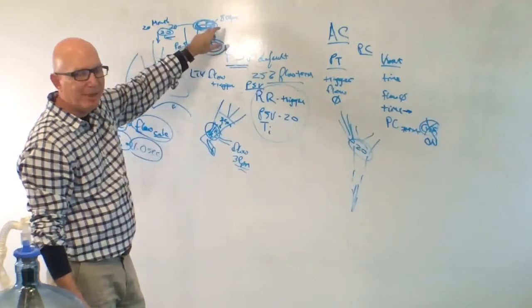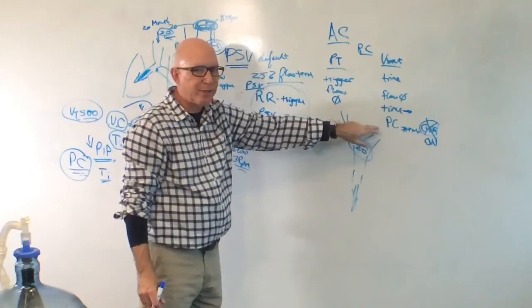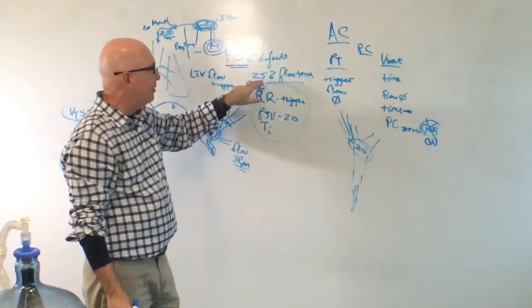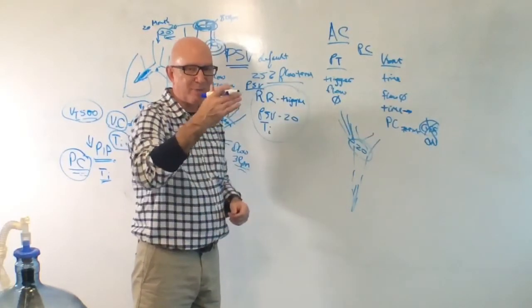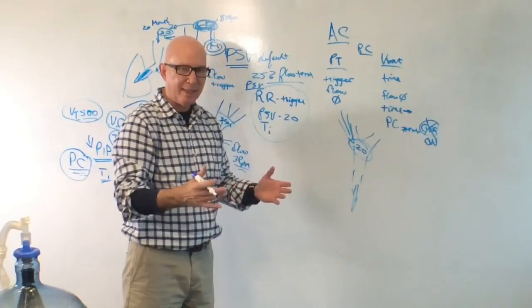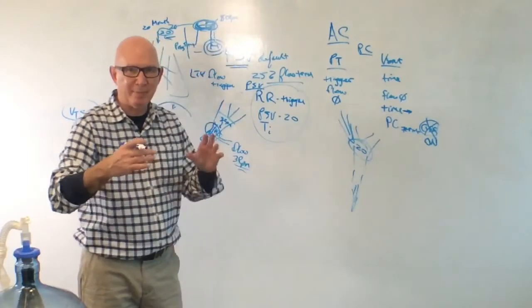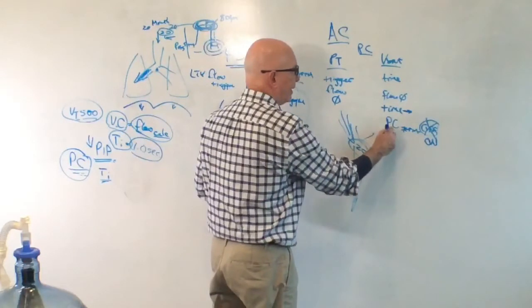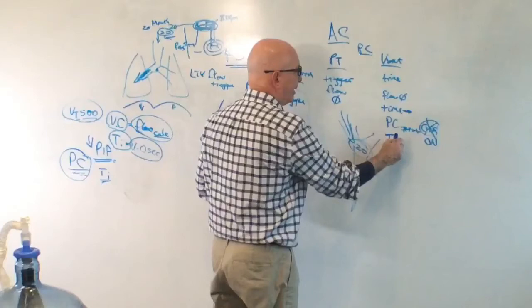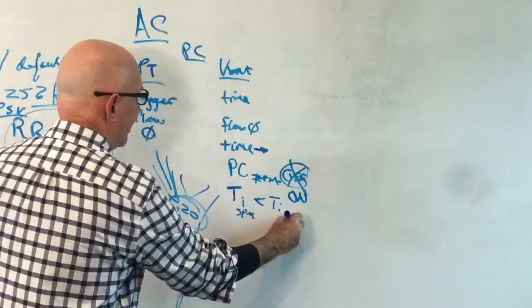Now this is a bit cluttered up here, but again, the definition is that once the flow within this pressure controlled inspiratory breath deteriorates to 25% of what the peak flow was in that breath, then the machine cycles to expiration. So it drops the pressure down to your level of PEEP, and if the patient's still inhaling, and they will be for a brief period of time, the machine will allow them to finish their inspiration without having that pressure there. So the one benefit of that is that it can help in the patient who has a spontaneous inspiratory time which is less than the I time of the ventilator. And so you're going to take away some of this discomfort.